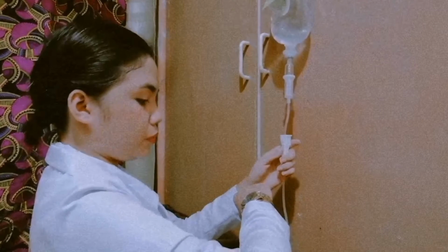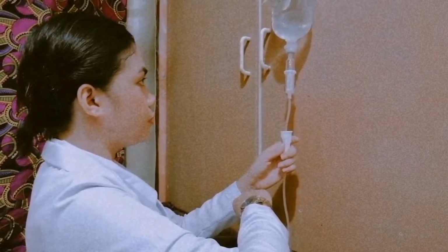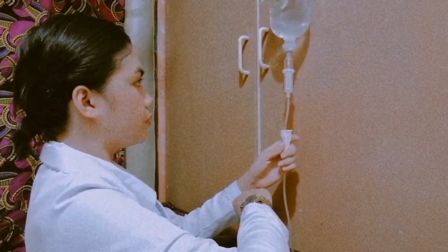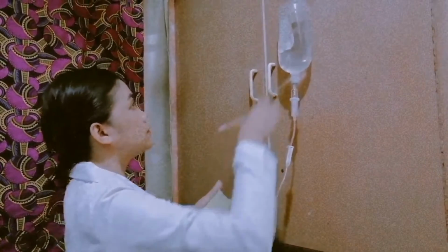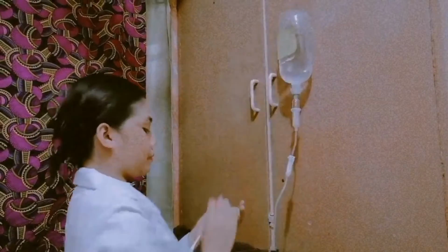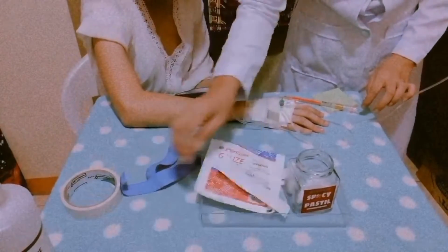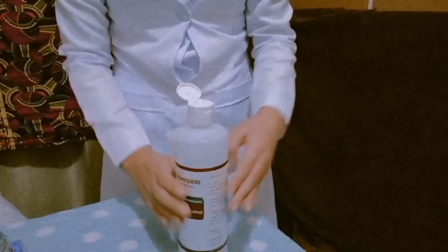Next is to adjust the rate of flow according to the doctor's order. The physician prescribes the rate of flow. The next procedure is to complete the label and tape to the IV fluid bag or bottle. The next procedure is to do the aftercare of the equipments and wash your hands.